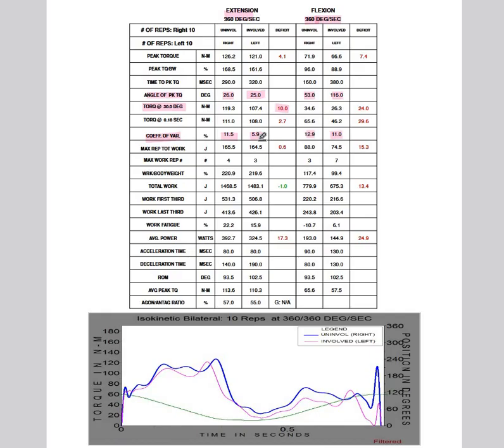You ask, is any limb injured? Are you healthy? Are you fit? Are you having this test conducted for a reason? Are you recovering from an injury? Things like that. But also a learning effect, and there are cases where, or I've heard of, not experienced them myself, where people have tried to skew the results if they're trying to mask an injury, but it's not something that you would need to worry about for the sake of your assessment.